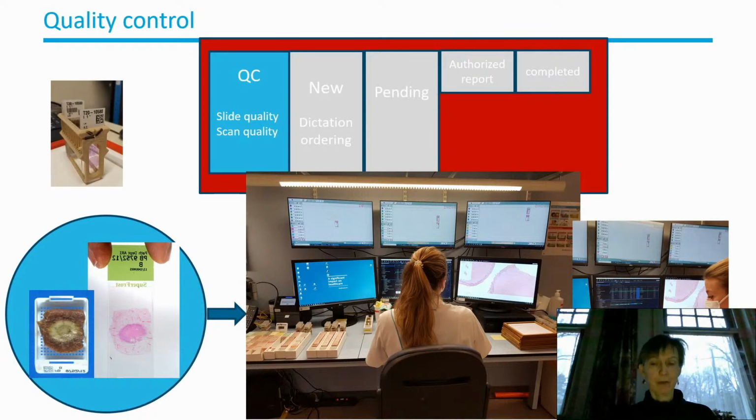I want to show you a very essential part in this whole system, and that's the quality check done by the technician.